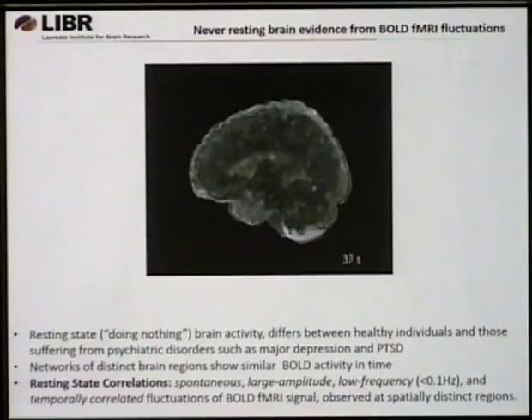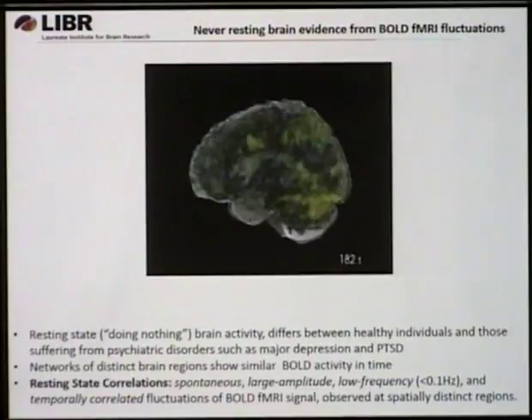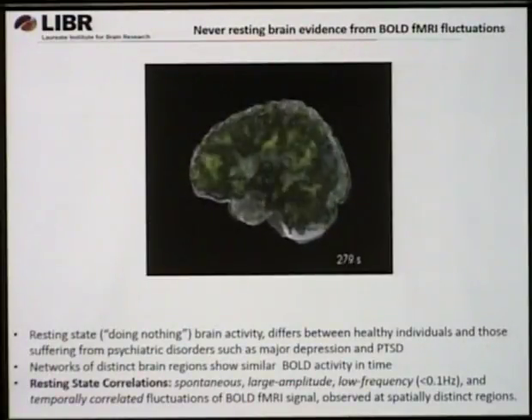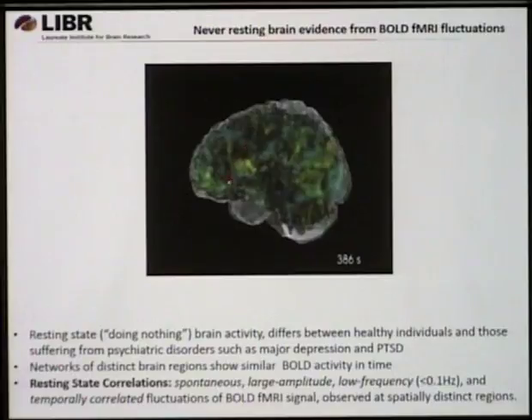You see, it looks like random variation, but in fact, if you notice, it's not really random. There are so many brain areas which are co-activated during rest. This is reflected by, for example, the yellow color. It's very similar here, and those colors reflect similar activity across different brain regions.